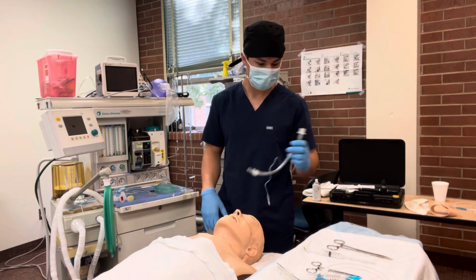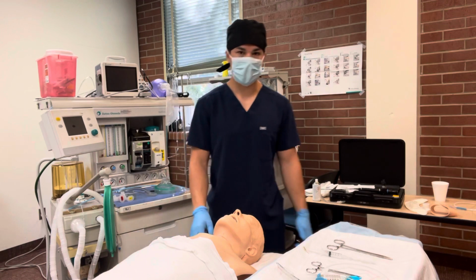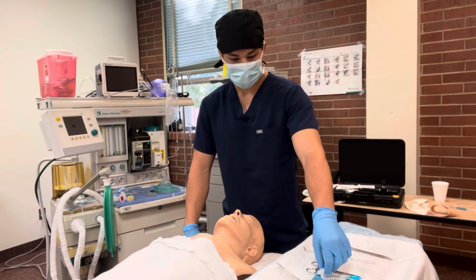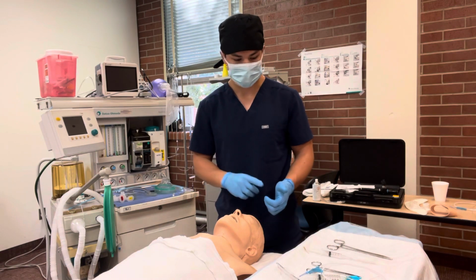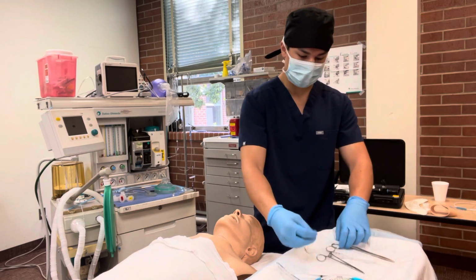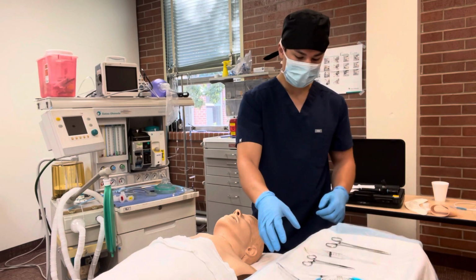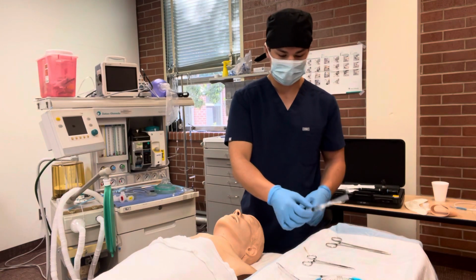My next method that I can use is a retrograde wire intubation. So my patient is lying flat. I'm going to gather supplies like a wire from a central line kit, hemostats or Magill's, a tracheal tube, a large bore needle like a 14 to 18 gauge, and a syringe.